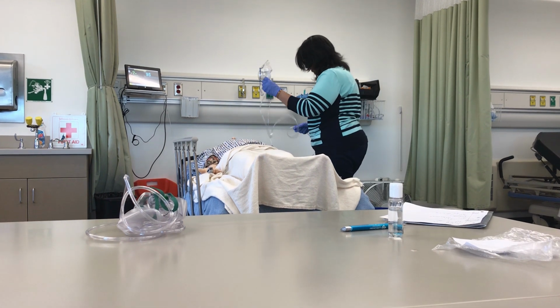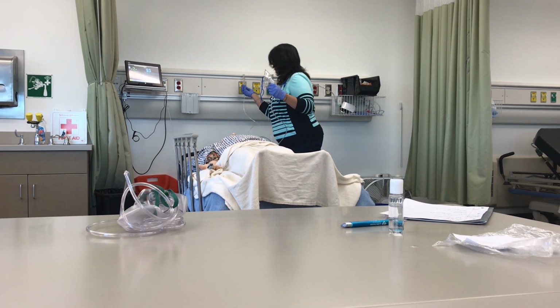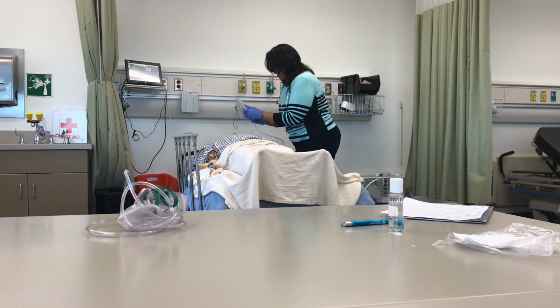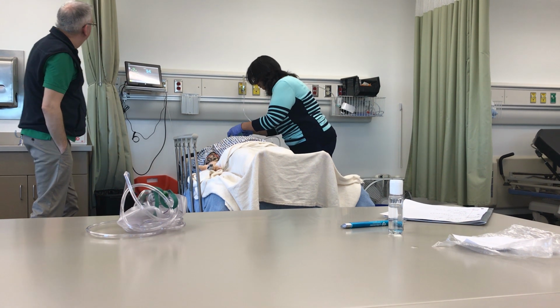Okay. Alright. That's awesome. Let's get you all there. Okay, so this is called albuterol, which is a bronchodilator treatment, which is going to help you open your lungs. So let's put this on.